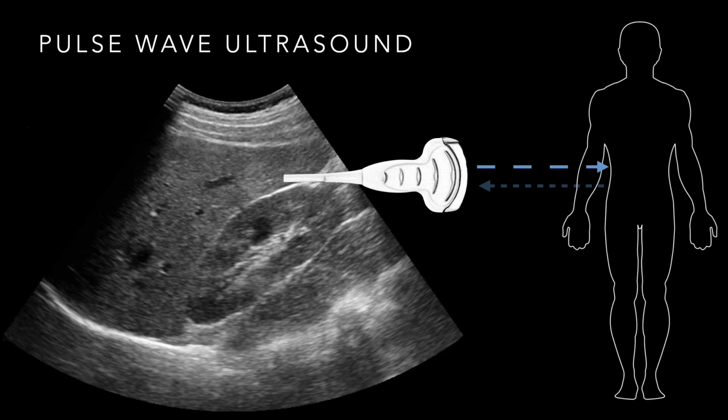So again, backing up, I want to go back to our base understanding of ultrasound, all the way back to the beginning, the basics. How does the probe work? We'll build from there. As you're holding this probe in your hand, it's emitting a sound wave. It's also listening for the returned echoes of that sound wave.